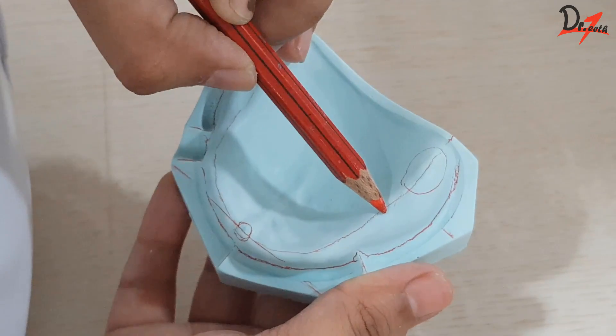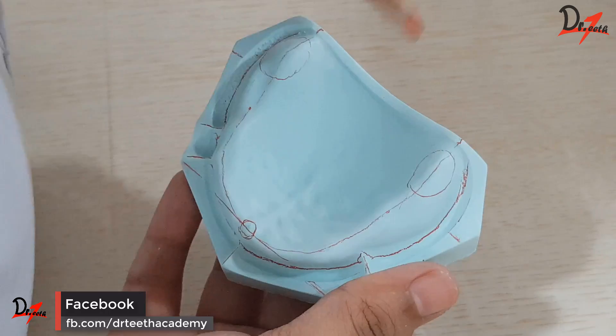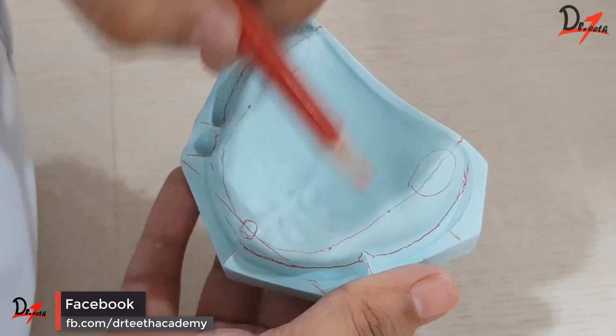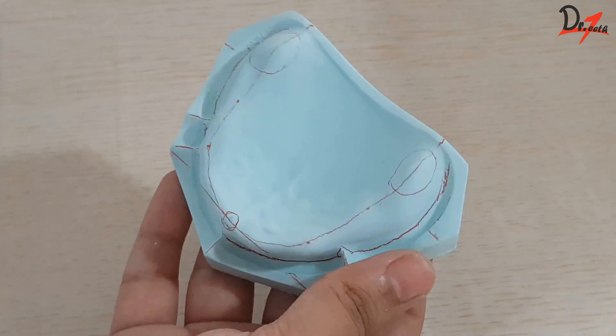Now we will extend the line from the crest of the ridge on the anterior surface of the cast. That will help us in making the occlusal rim and setting up our posterior teeth.